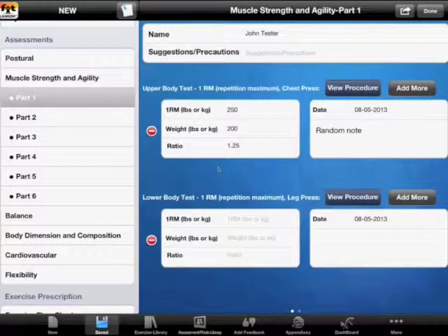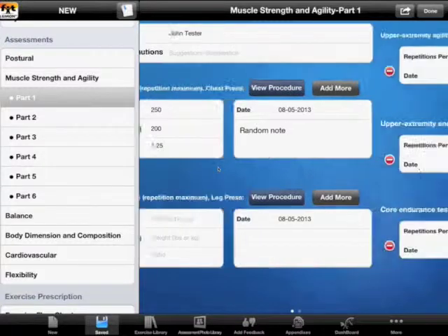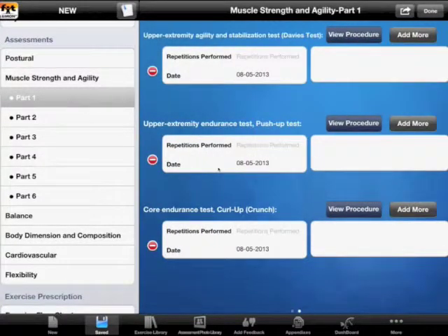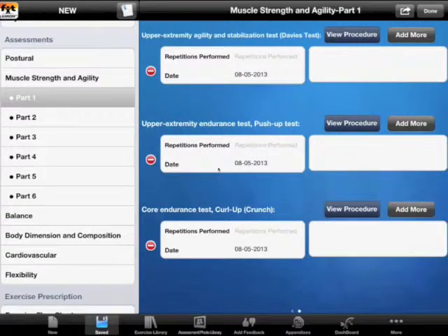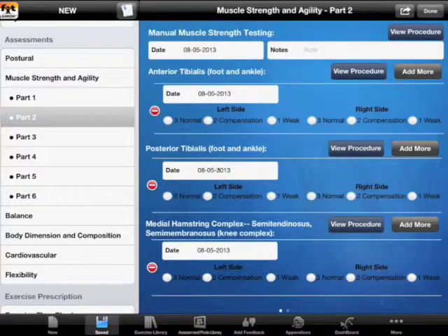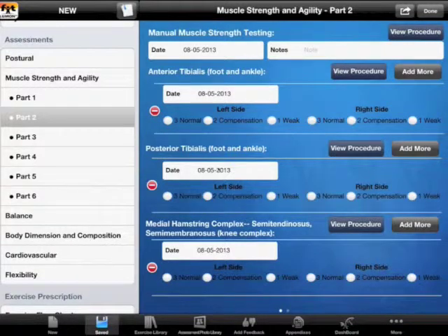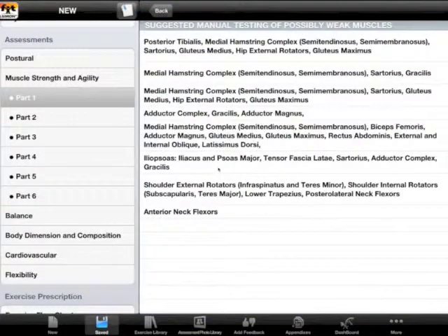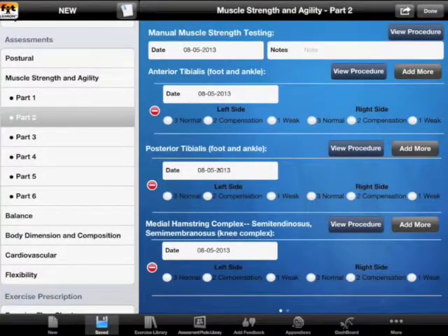We can also very quickly delete entries. Lower body tests and all other tests have results calculated automatically after you input the initial numbers. We have more tests here such as the Davies test, push-up test, and curl-up test. Then in part two we begin manual muscle strength testing, where we have all different muscles we can test, and based on our suggestions and precautions we already have highlighted which muscles should be tested.